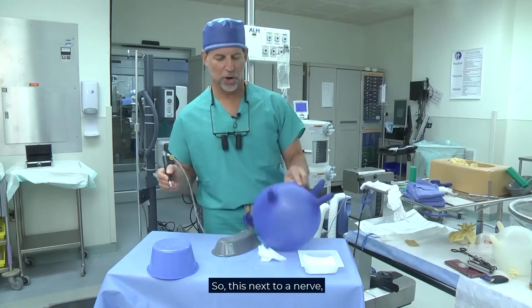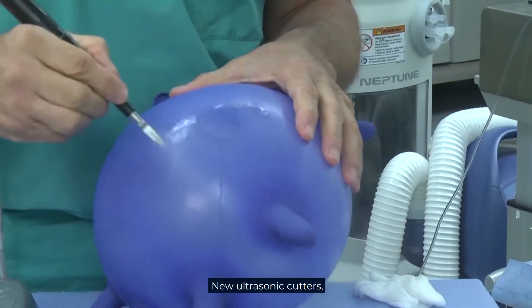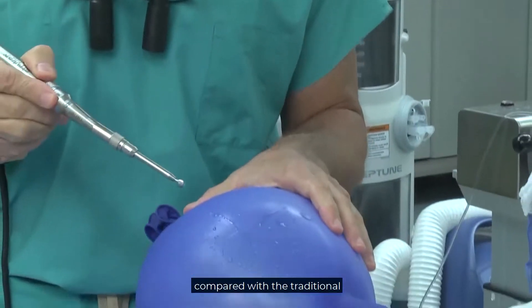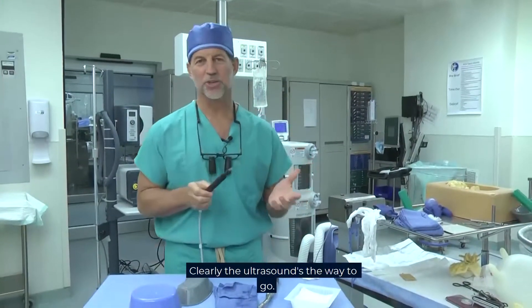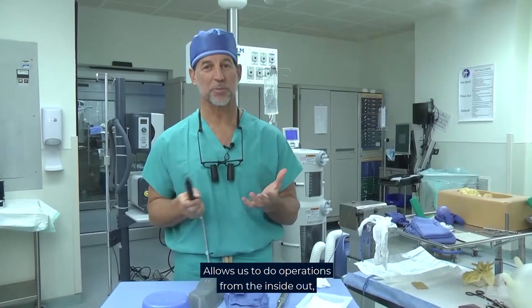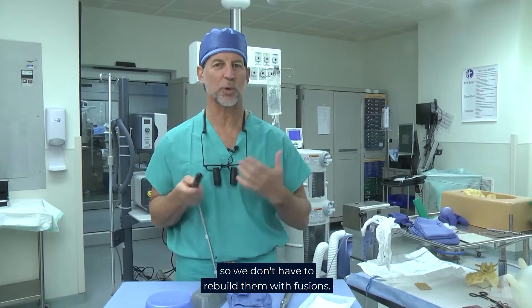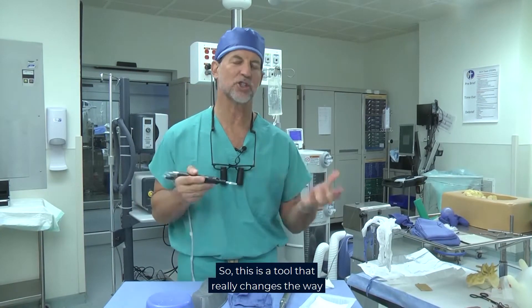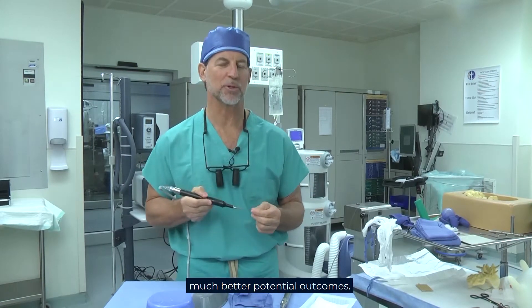So this next to a nerve — ultrasonic cutters compared with the traditional bone cutters — clearly the ultrasound is the way to go. It allows us to work in very tight spaces, allows us to do operations from the inside out, and we can preserve and save native structures so we don't have to rebuild them with fusions. This is a tool that really changes the way we do spinal surgery in a way that gives patients much better potential outcomes.